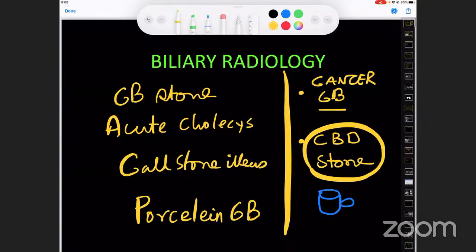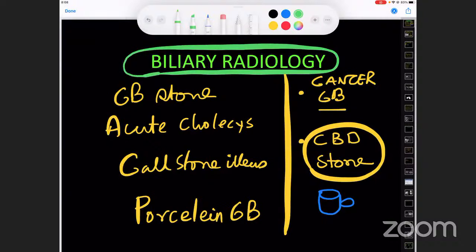Okay, and I think the last part of biliary radiology is something that the both of us decided will be exclusively on bile duct injuries, because again we will have 2 gastrointestinal surgeons with me, and we will go threadbare talking of the surgical aspect. Why does an injury happen? Not only how to prevent an injury, we have had many things to prevent an injury, and then to talk about the radiology, about how to know vascular biliary injuries. So we have planned to discuss the biliary radiology in these parts.